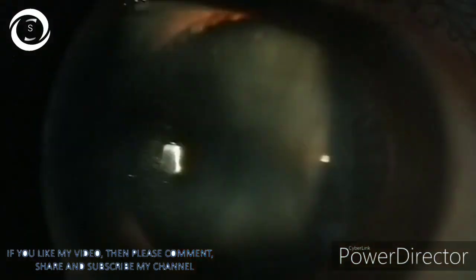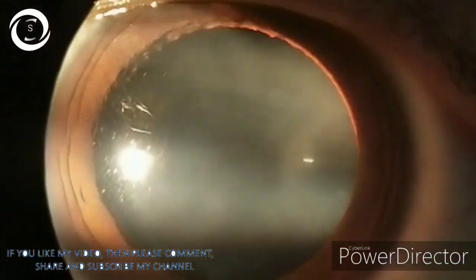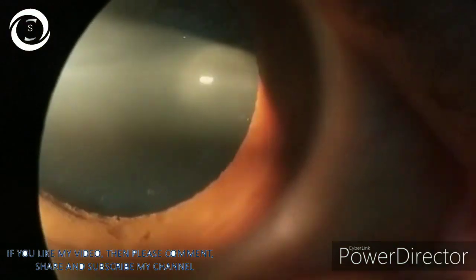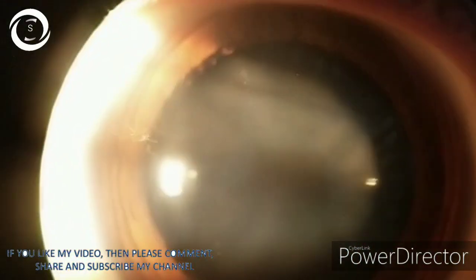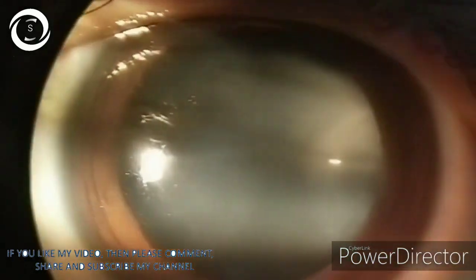Today we will perform clear lens extraction of the right eye. I will show step by step how you perform clear lens extraction. Chances of retinal detachment are high in high myopes, especially after YAG capsulotomy and even after cataract surgery, especially if posterior capsular rupture occurs during the procedure. So it is better to counsel the patient for 360-degree peripheral retinal photocoagulation either before or after clear lens extraction to minimize the chances of retinal detachment.